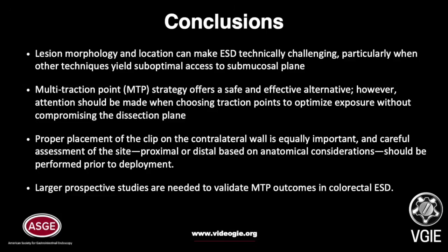In conclusion, lesion morphology and location can make ESD technically challenging, particularly when other techniques yield suboptimal access to the submucosal plane. MTP strategy offers a safe and effective alternative. However, attention should be made when choosing traction points to optimize exposure without compromising the dissection plane. Proper placement of the clip on the contralateral wall is equally important, and careful assessment of the site, whether proximal or distal, based on anatomical consideration, should be performed prior to deployment. Large prospective studies are needed to validate MTP outcomes in colorectal ESD.